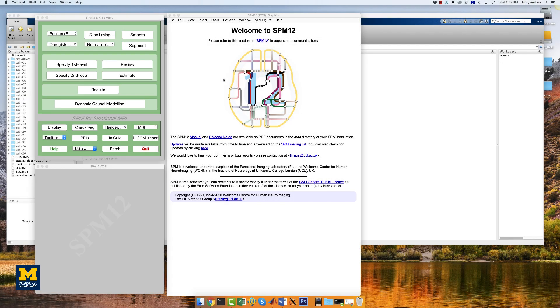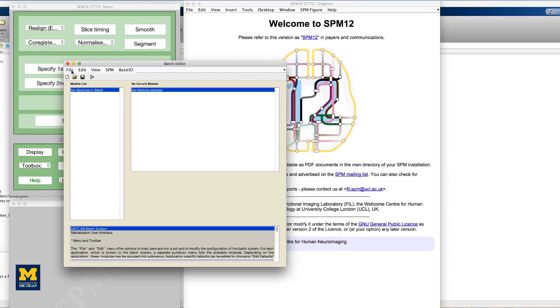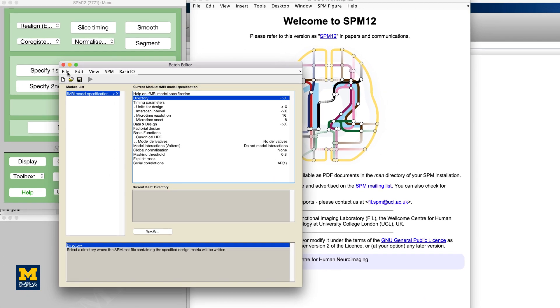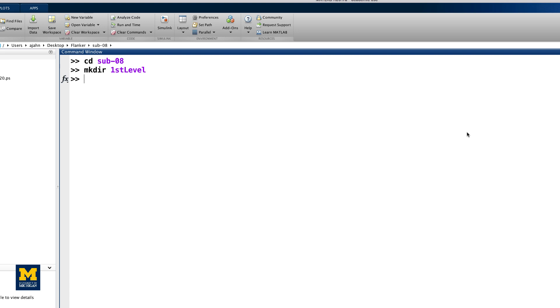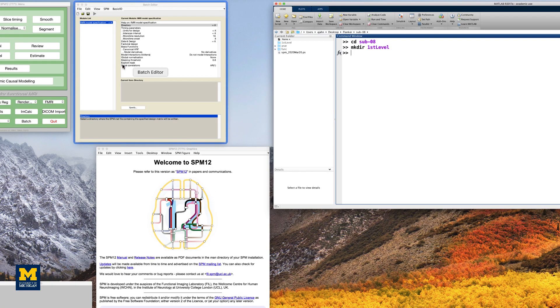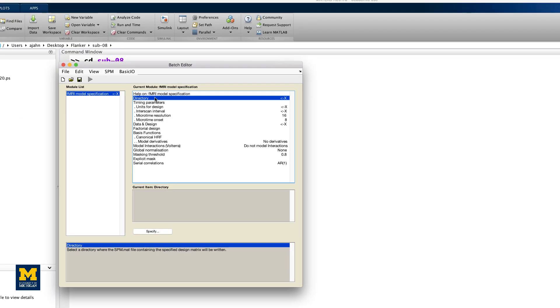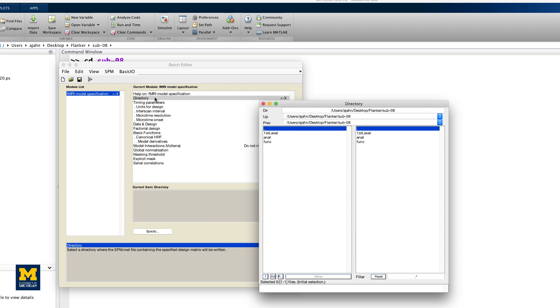To begin, from the SPM GUI, click on Specify First Level. Note that the first field that needs to be filled in is the Directory field. To keep our results organized, go to the MATLAB terminal, navigate to the Sub08 directory and type mkdir First Level. Then, double-click on Directory and select the first level directory you just created.